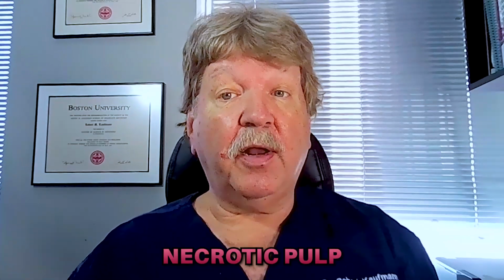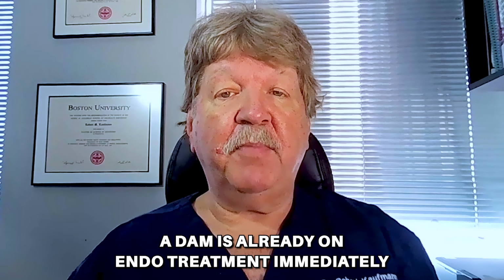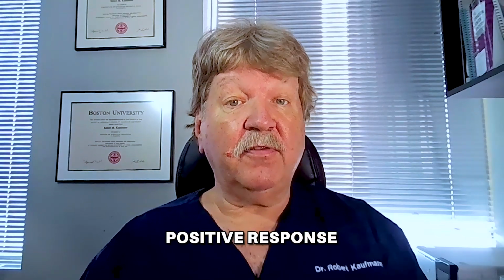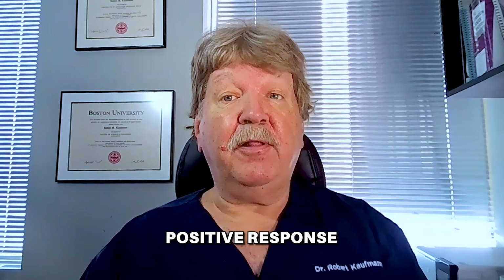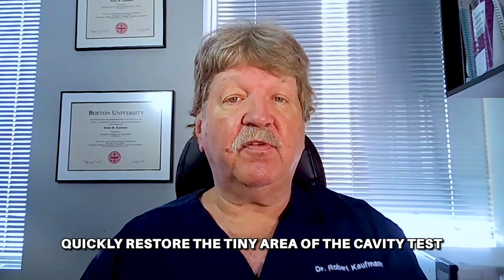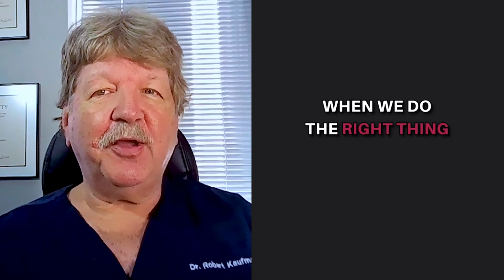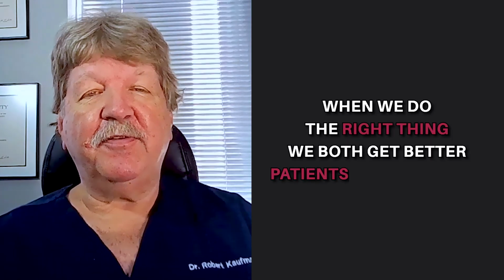In the case of a necrotic pulp, the dam is already on, and we can proceed with an endo treatment immediately. In situations where we get a positive response, the pulp is vital, or when no response is expected, and we do get a vital response, we can then quickly restore the tiny area of the cavity test and the sensitive tooth and refer the patient to the appropriate specialist for further evaluation and diagnosis. Remember, when we do the right thing, we both get better, patients and clinicians.